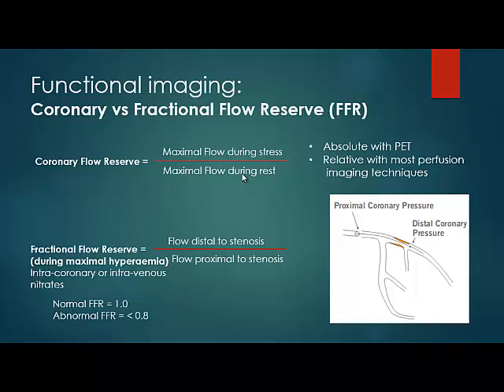If you see absolute reduction in blood flow, then you can say there is ischemia in the myocardium. And we can do that. The PET-CT is the gold standard for quantifying, but we may also be able, in theory, to do it with cardiac MR and also with cardiac CT.